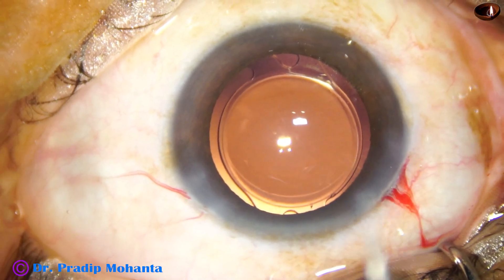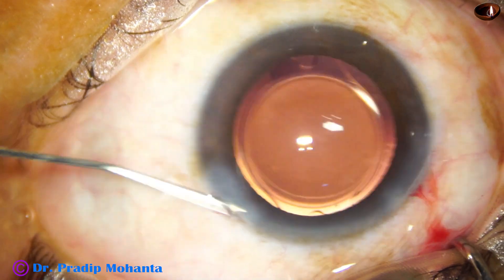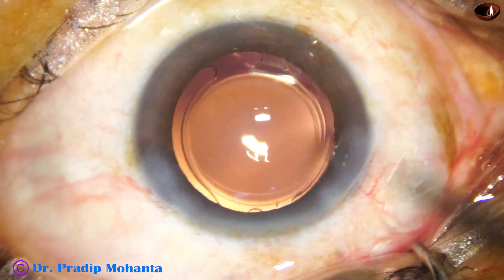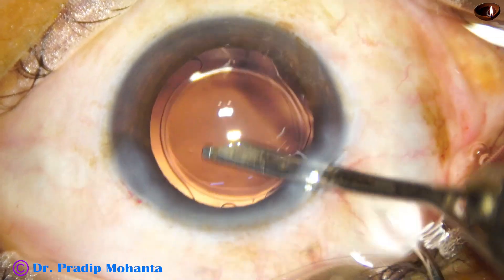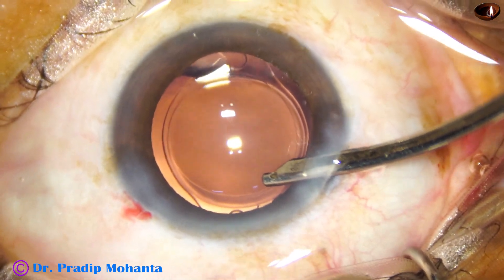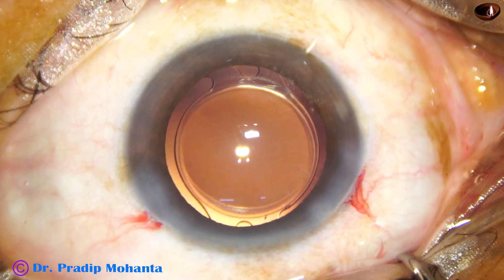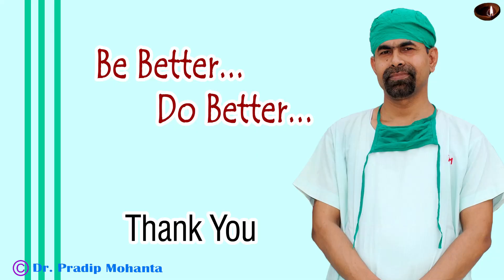There is a bit of miosis. The side port is nicely closed by hydrating the corneal stroma, and then a final lavage of the anterior chamber is done. The integrity of the wounds is then checked and then we conclude the case. Thank you very much for your attention.